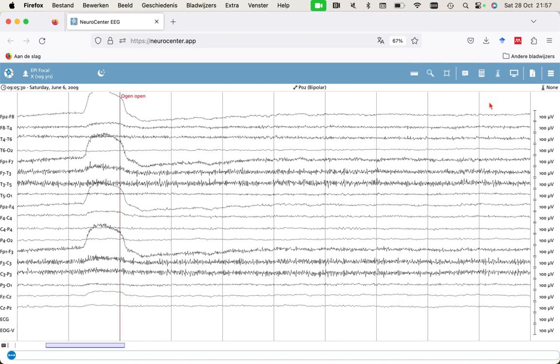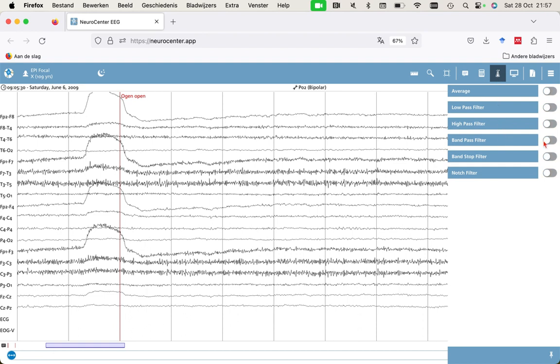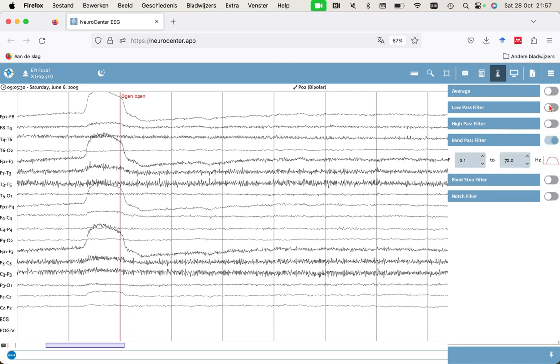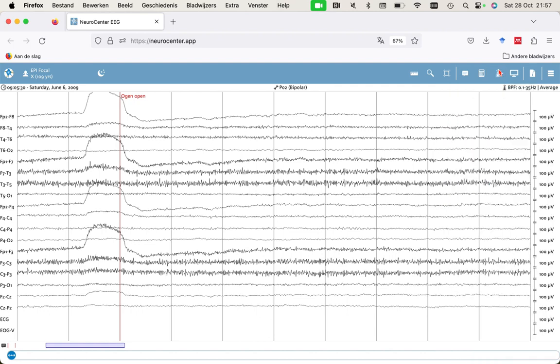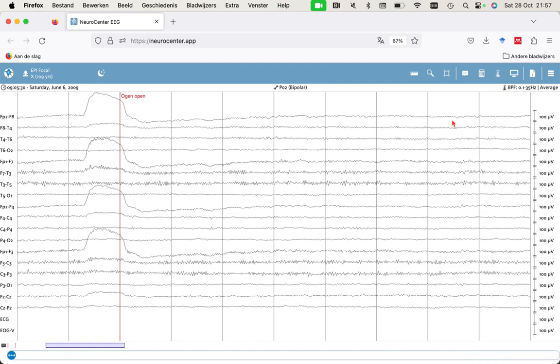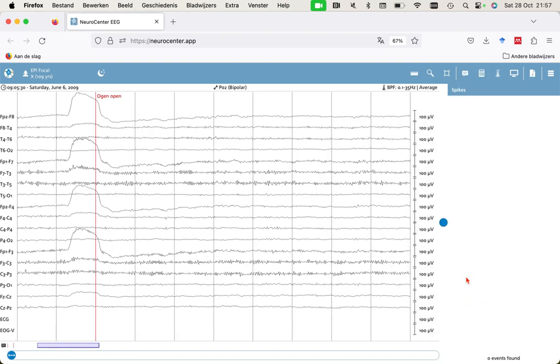But the fun part is to let the algorithm do the work. You can set some filters if you like, and that's all very self-explanatory. But let's start the algorithm. AI for Interictal Epileptiform Discharge Detection.